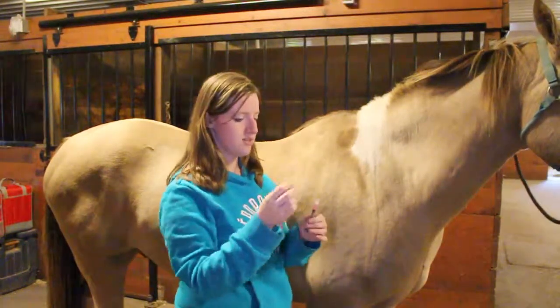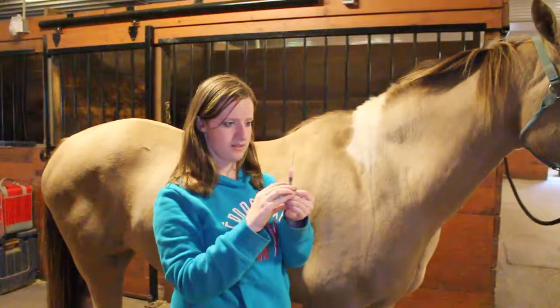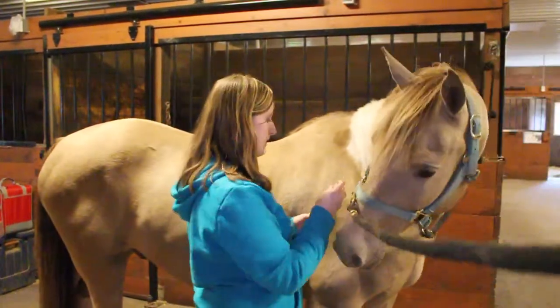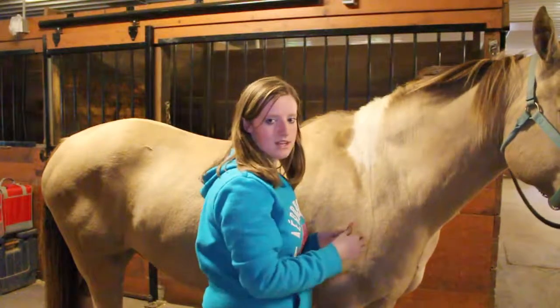Before giving the shot, you always flick it a couple times. Make sure all the air bubbles come out. I always pet my horse a couple times and tap them a few times to make sure that they know that something's coming.